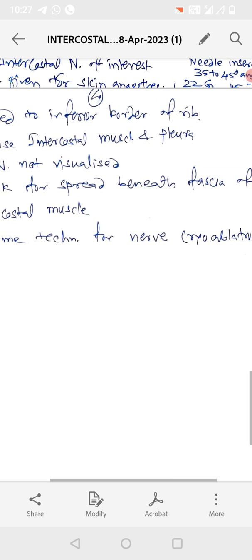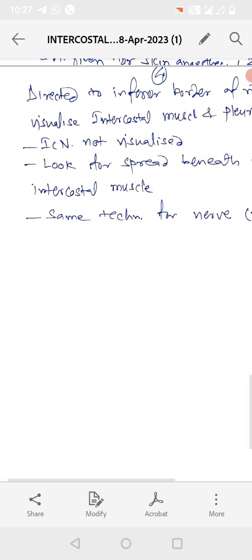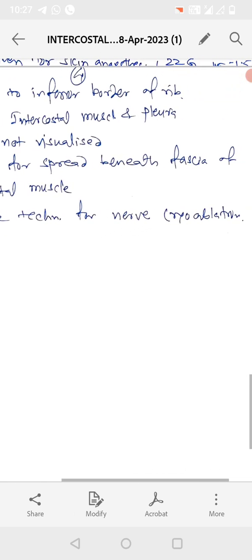Intercostal nerve is not visualized. Look for spread beneath the fascia of the intercostal muscle. Same technique for nerve cryoablation can be used. Thank you.